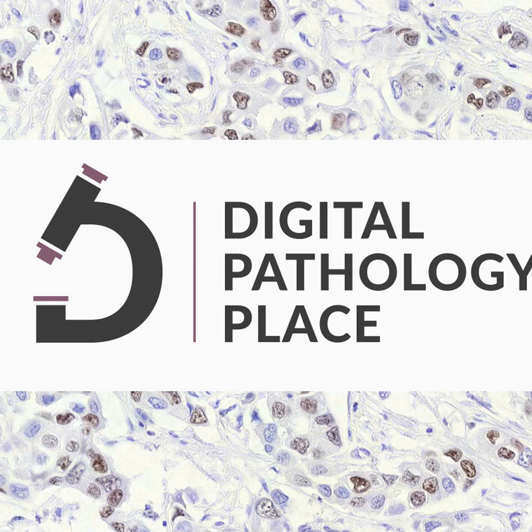What they suggest is that clinical trials should incorporate suitable protocols to verify biopsy size that optimize digital fibrosis assessment using two-photon excitation fluorescence microscopy. This one, I assume, is glass-free, basically a stain-free and processing-free way of imaging.